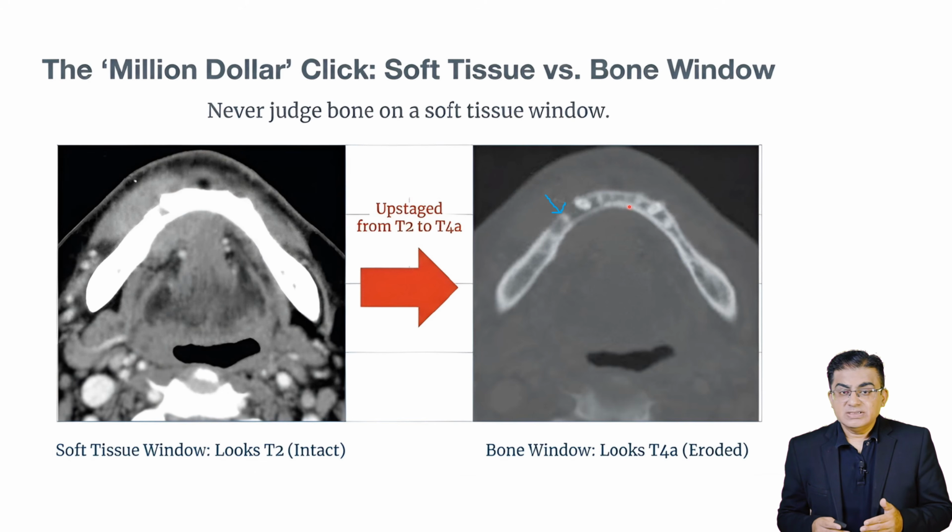That is why when you are asked in exam which imaging modality will you do for a buccal alveolar RMT carcinoma, and you have decided to say CT neck, do not just say CT neck. You should say CECT neck with puffed cheek and bone algorithm reconstruction. Let us move to our main topic of discussion now, imaging for lateralized tumors.